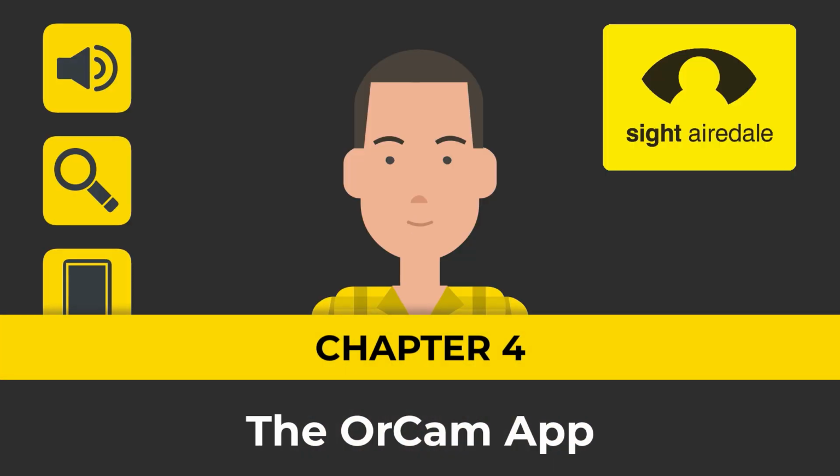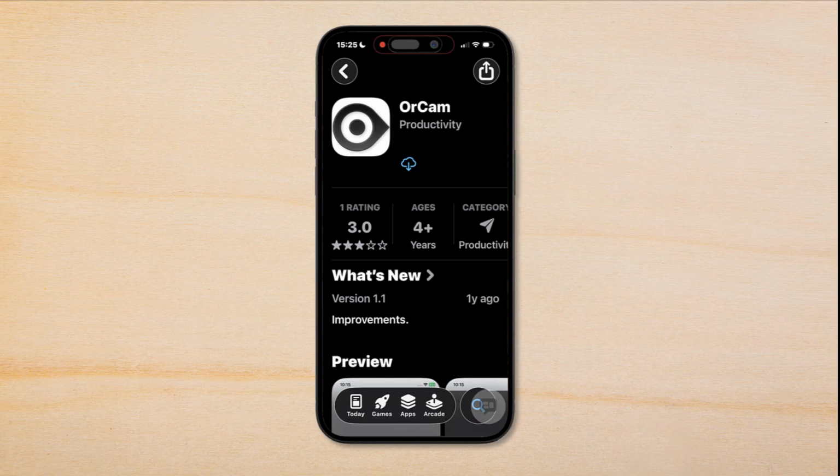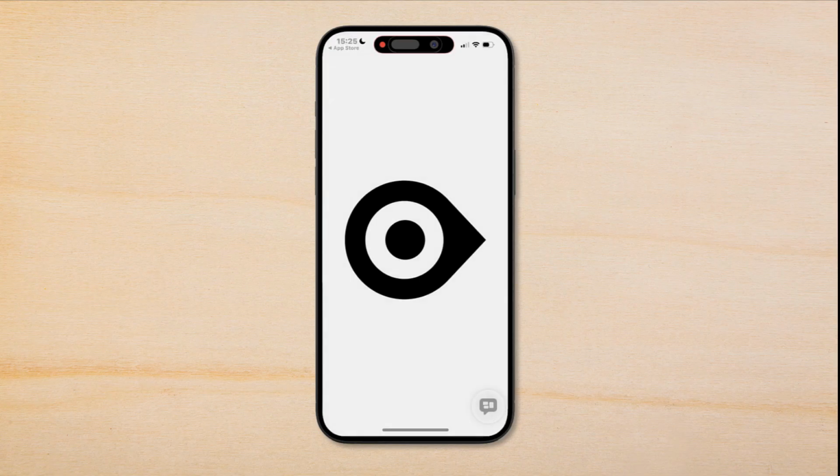So as well as being able to control your OrCam using your voice and gestures, you can also control it via the OrCam app. So to install the OrCam app, first go to your App Store and search for OrCam. Then I'm going to download the app and tap Open.